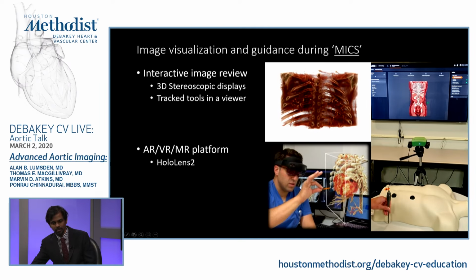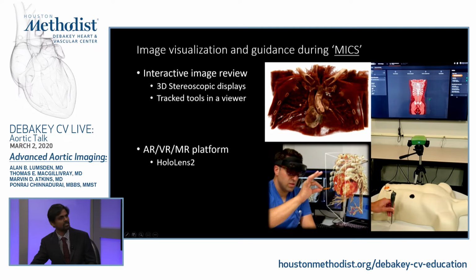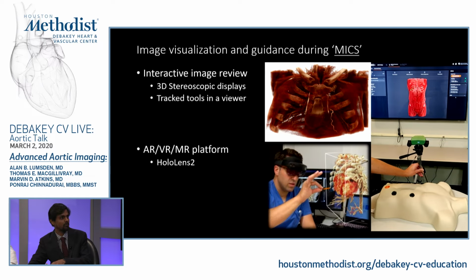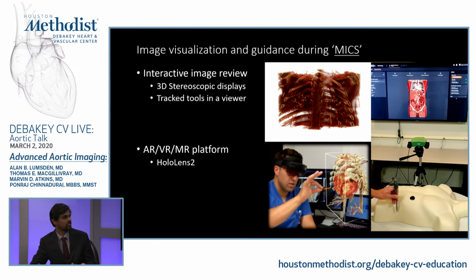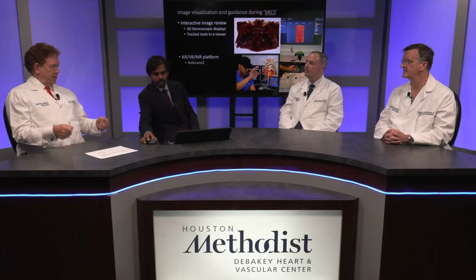And there are even other platforms such as AR, VR, or mixed reality platforms, and there are more and more of these solutions that will be out there. I personally foresee that those will be the framework that I was talking about in an open operating room, where within a few seconds you'll be able to pull the CT or MR or echo images of that particular patient before you even do your first incision. The visualization is an iPad equivalent that you can hold over the chest and say that's where the LIMA is, make the cut here. So we can link it to the tool, or to an AR platform, or just use any kind of window, like an iPad-type display.